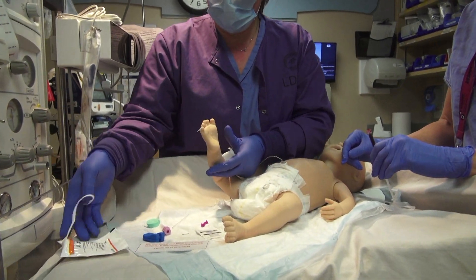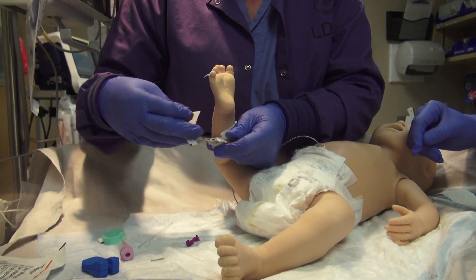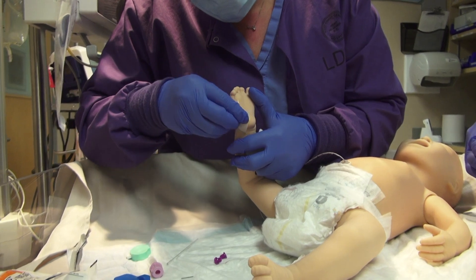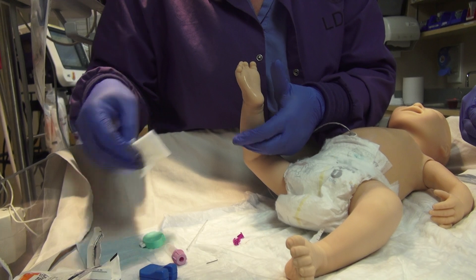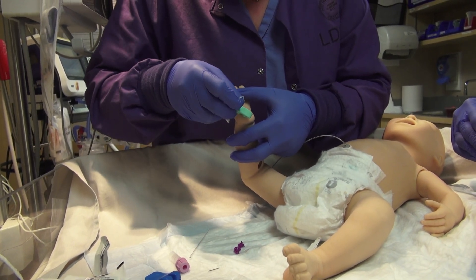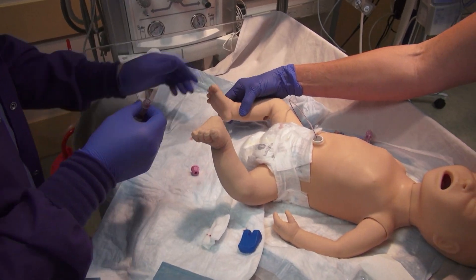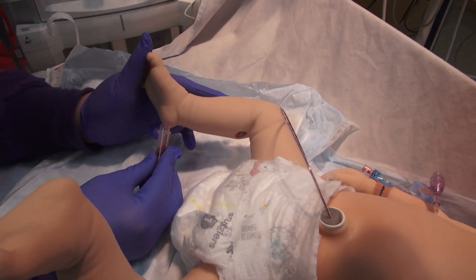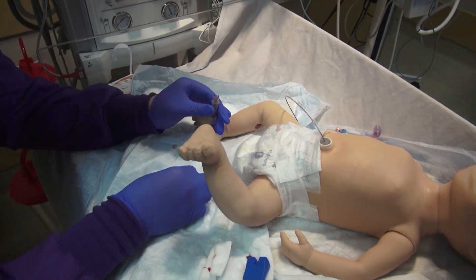The CBC and acute cap gases can both be drawn from a capillary sample. Pre-warm the skin puncture site — this will increase the blood flow seven-fold and prevent excessive milking or squeezing. Make sure the alcohol dries, as alcohol can have a hemolytic effect on red blood cells, and wipe away the first drop of blood collected. Avoid milking and scraping of the puncture site as this technique can promote platelet clumping and clotting. Use the lavender microtainer and fill in between the first and second line.